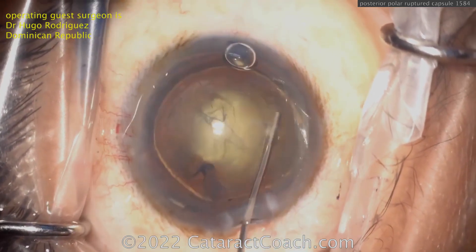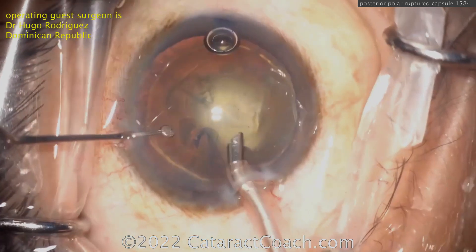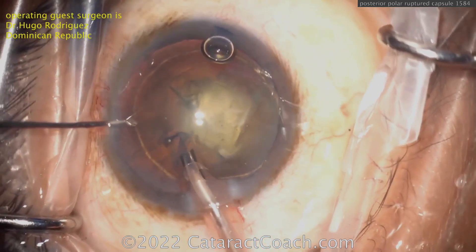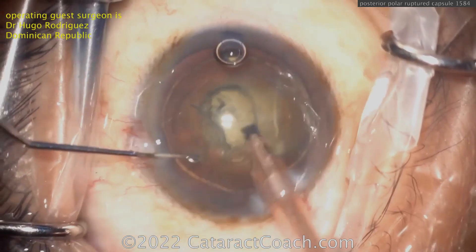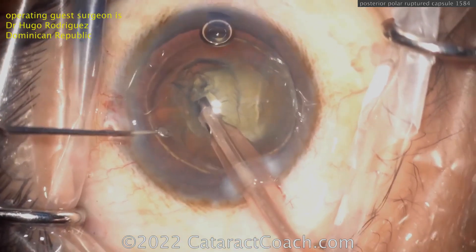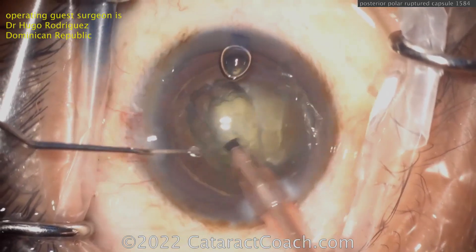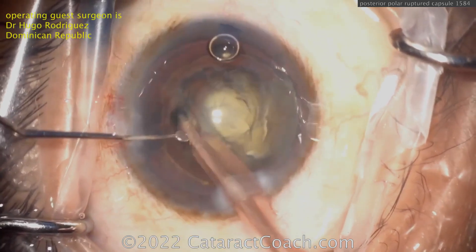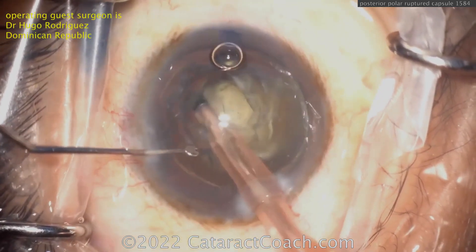A little hydrodelineation here, nicely done. Notice — no hydrodissection. Very smart move here. Going in with the phaco probe, the goal is to get that endonucleus out of the eye. The delineation separates the endonucleus while leaving the epinuclear shell and cortex still in the bag. In a posterior polar, no hydrodissection — very important.